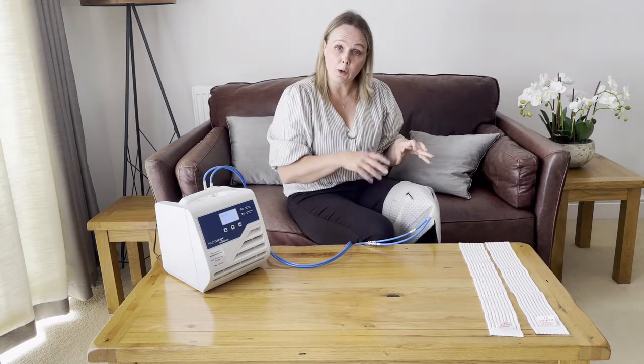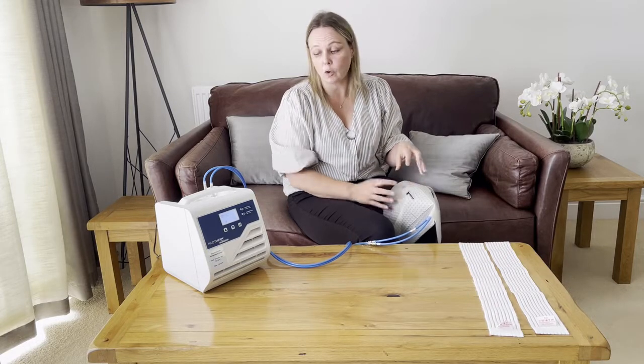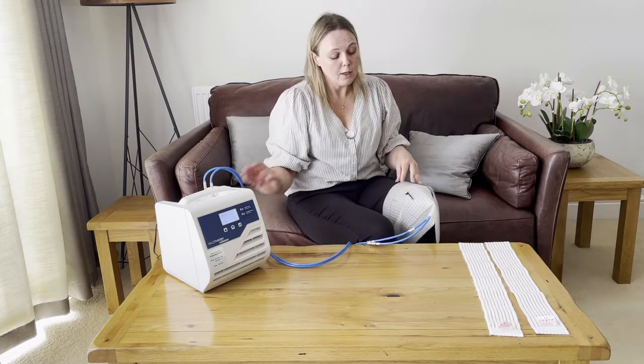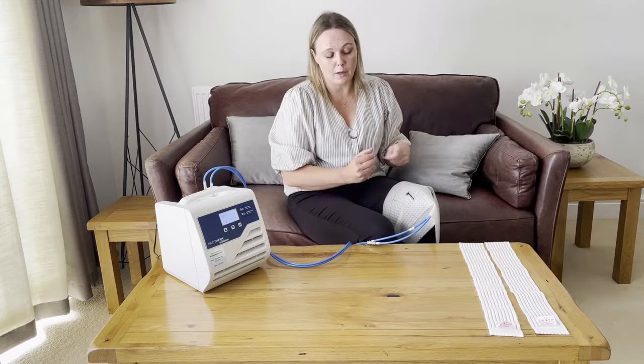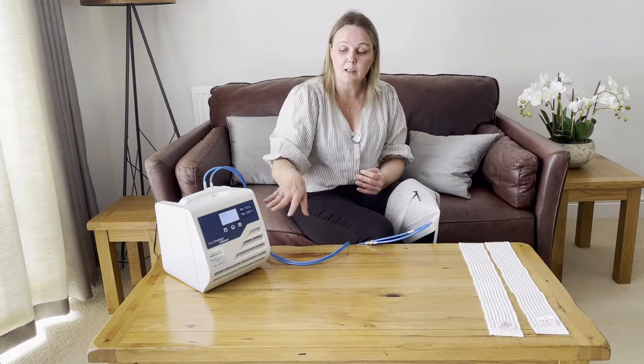It's worth bearing in mind that the lower you take the temperature, the more possibility there is of getting condensation on both the cuff and the tubing. If you do take the temperature down as low as it will go, you may start to get some moisture on the cuff or the tubing due to the difference in temperature between the cuff and the patient or the environment. If that happens, just increase the temperature very slightly.